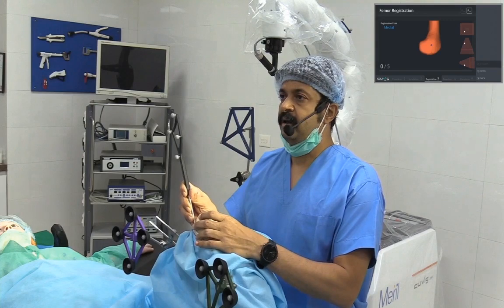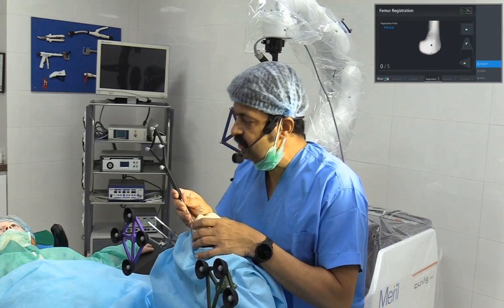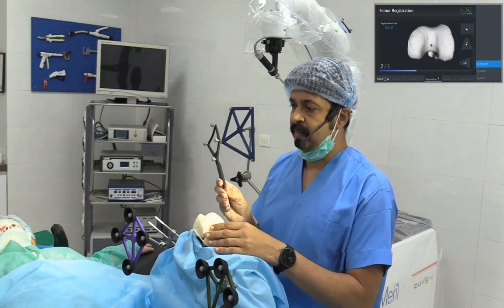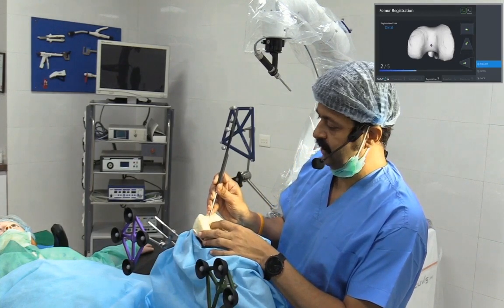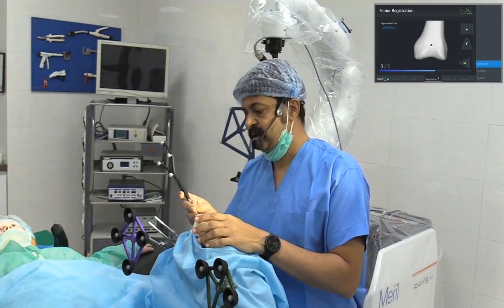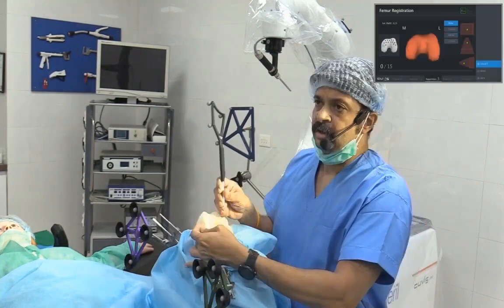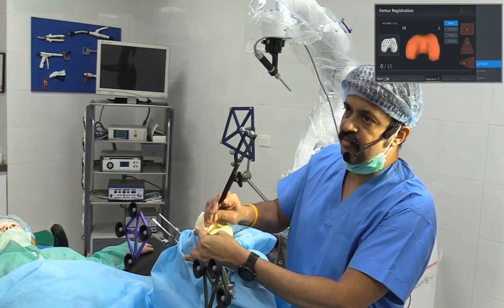So I'm going to take medial point. So this is the step of femur registration. As you can see, medial epicondyle, I'm there. Then it straight away tells you to go to the lateral epicondyle. This is what I have done. Then you can come back, and it is a distal registration point, and this is it. And then you can go to the anterior registration point. The position of the point is exactly shown by the computer, and you can actually come back and see the points. So on the femur, as you can see, I need to pick up something like 15 points.